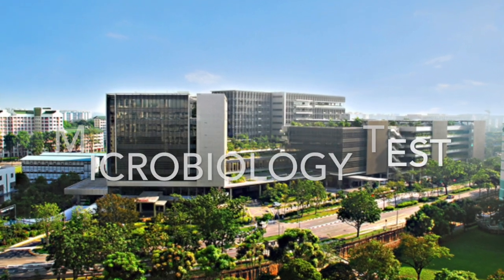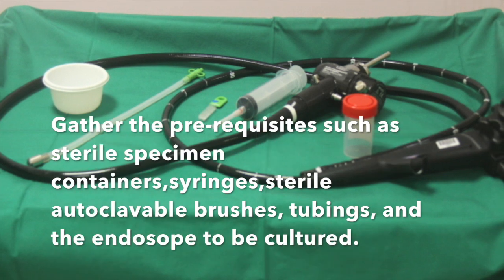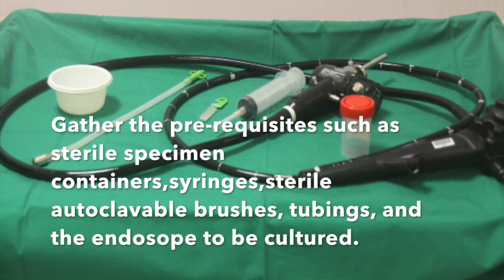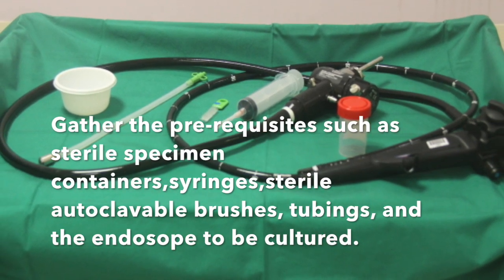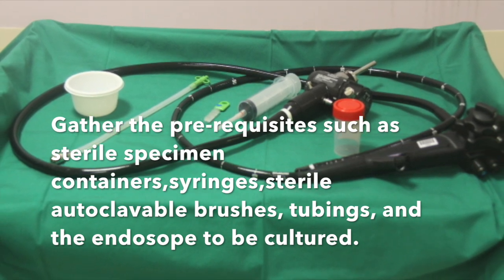Microbiology Test. Gather the prerequisites such as sterile specimen containers, syringes, sterile autoclavable brushes, tubings, and the endoscope to be cultured.